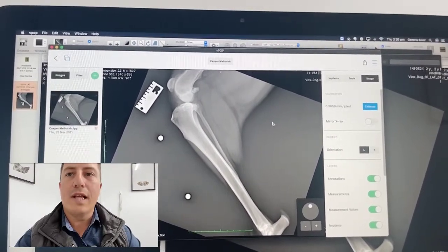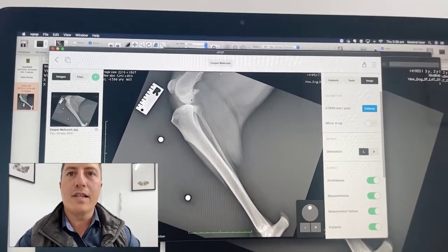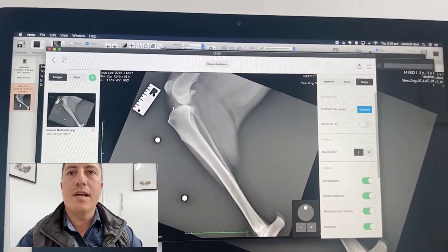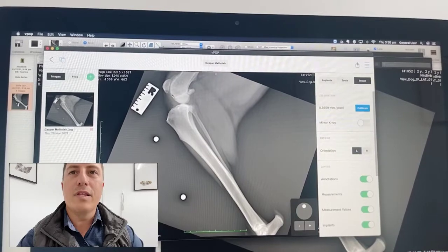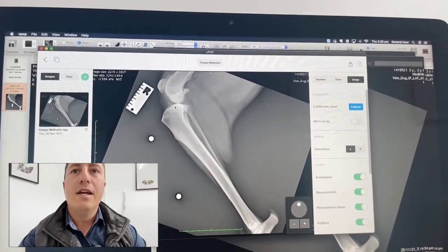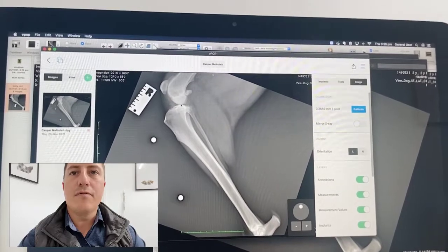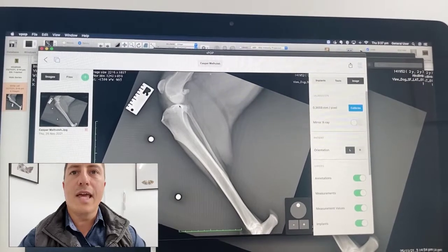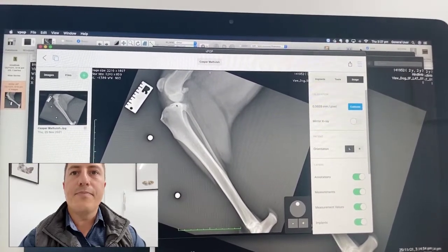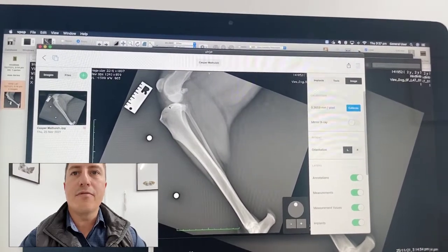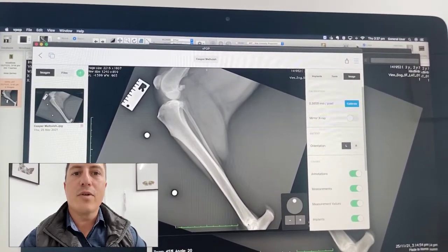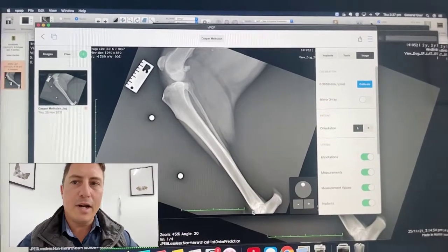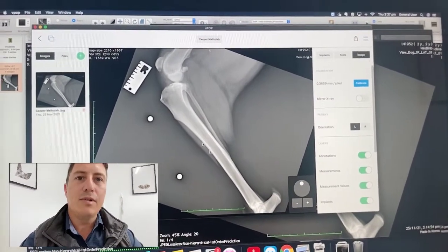To get you started, what we need first is our lateral x-rays. The first thing we want to look for is a nice straight lateral x-ray, so the femoral condyles are superimposed. We can see this dog has got a reasonably good amount of effusion in this knee, a little bit of arthritis, not a lot of secondary arthritic change. We're also looking specifically for superimposition of the femoral condyles to confirm the femur is straight, and we want to see the intercondylar eminences and the tibial plateau. This x-ray was taken at approximately 90 degrees of stifle flexion and 90 degrees of hock flexion to help get the positioning nice and straight.